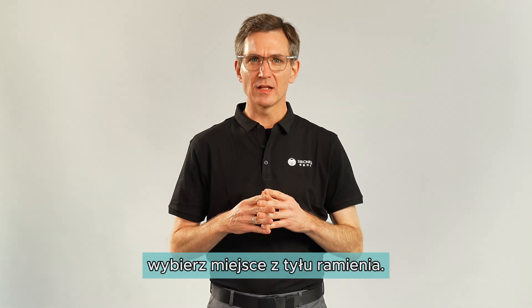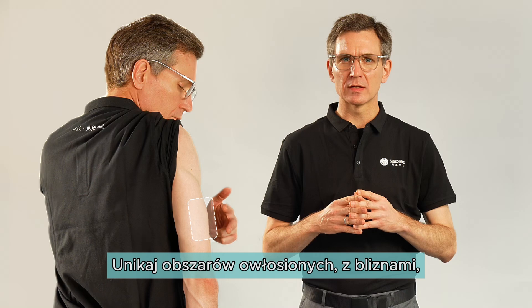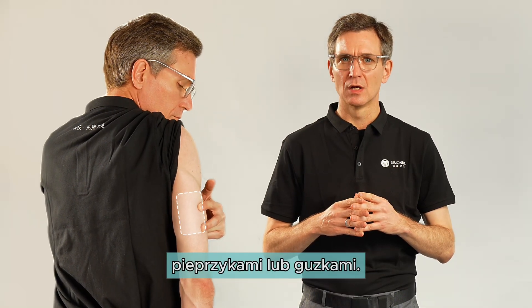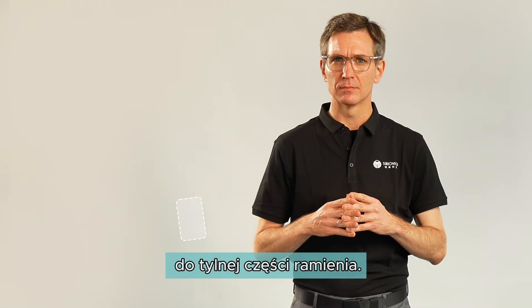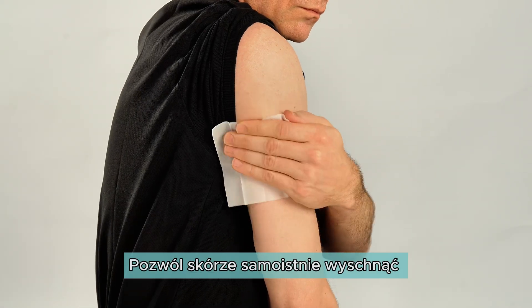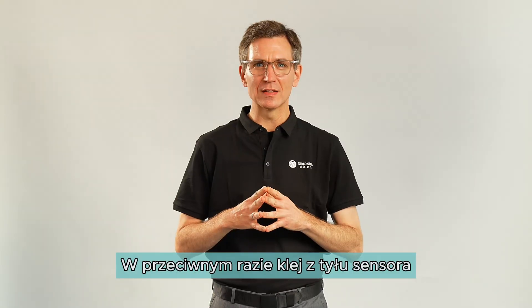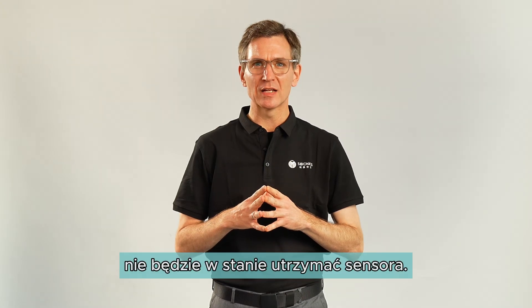Next, select a site on the back of your upper arm. You should avoid areas that have a lot of hairs, scars, moles, or lumps to ensure the sensor sticks well to the back of the arm. Use an alcohol wipe to clean the selected area. Allow your skin to fully air dry before applying the sensor, otherwise the adhesive on the back of the sensor may not be applied securely.